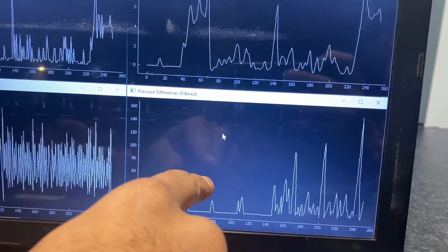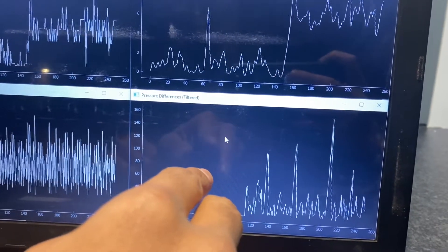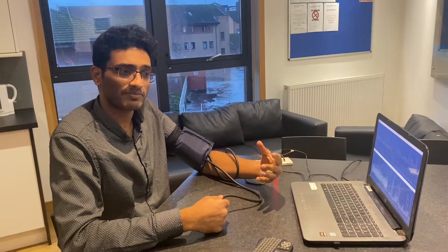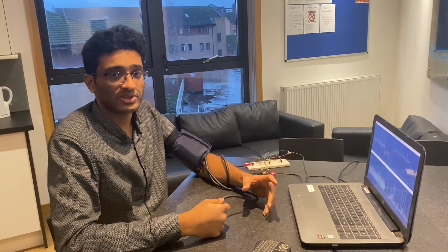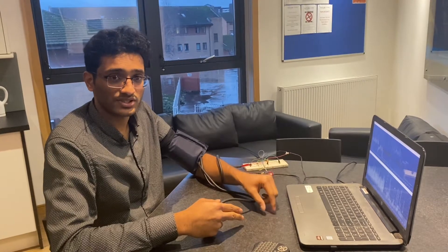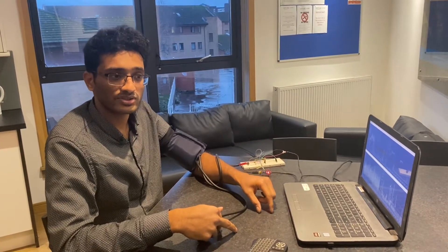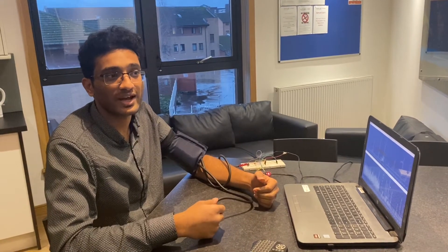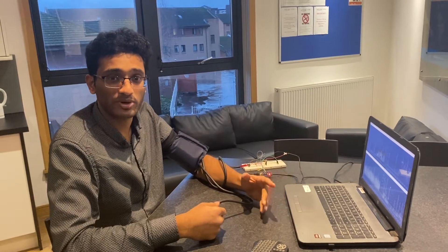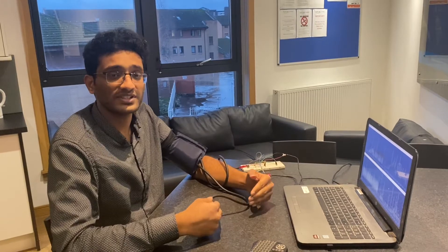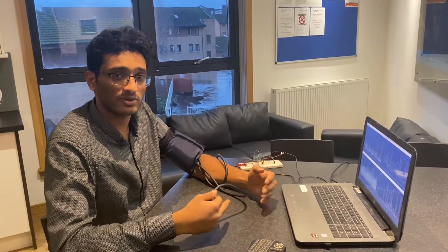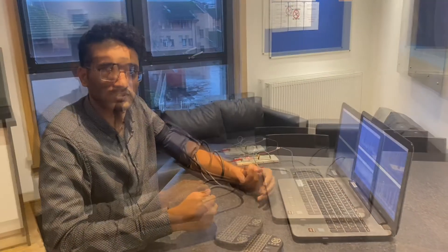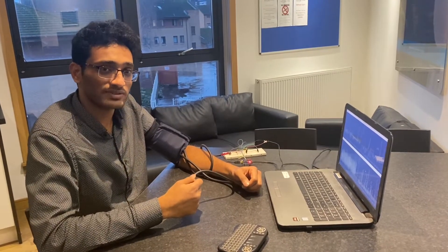We shall now inflate the blood pressure cuff and measure the readings. We are interested in two values: systolic pressure, which normally occurs around 120 mmHg, and diastolic pressure, around 80 mmHg. We will inflate to approximately 200 mmHg and then deflate from that point down to a pressure below the diastolic, around 30 to 40 mmHg.